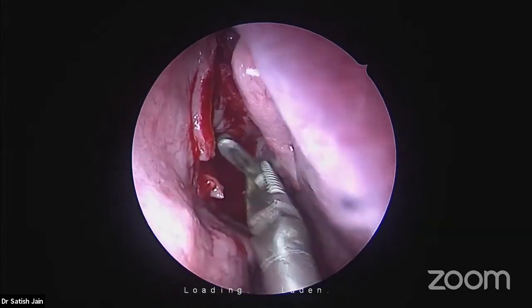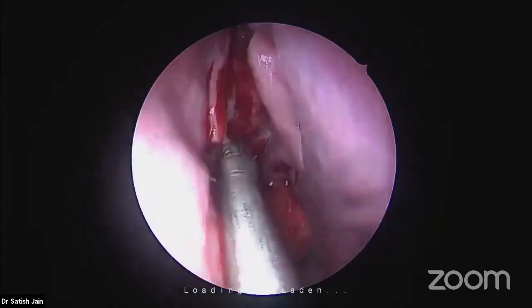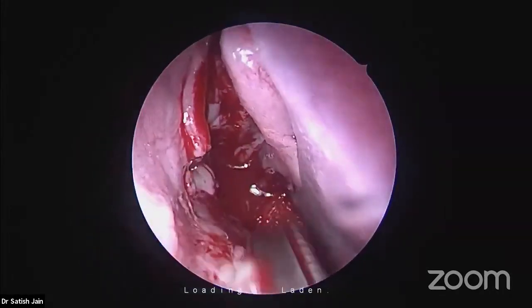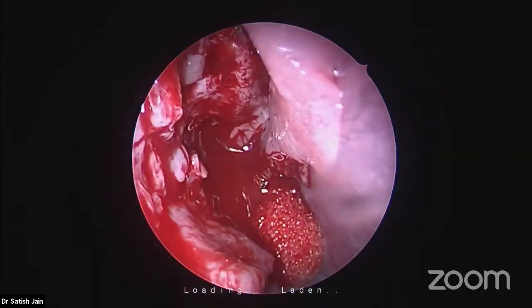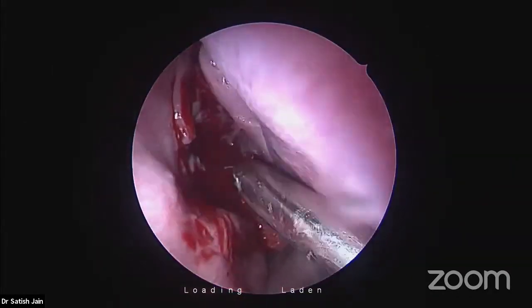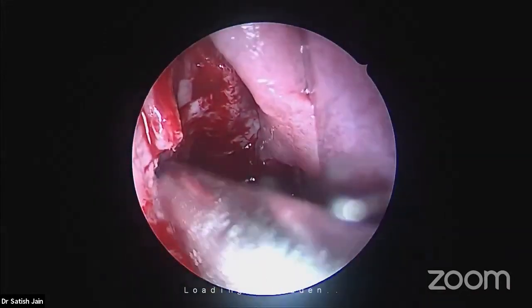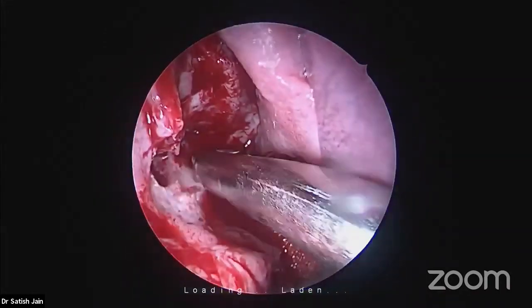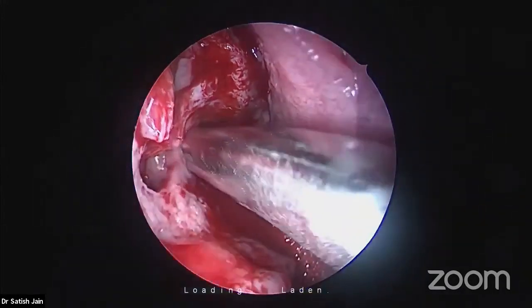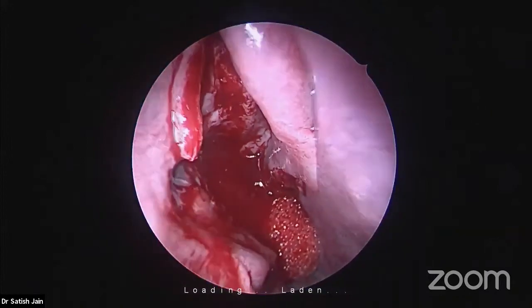This step is known as infundibulotomy. The only concern while coming this anteriorly is the nasolacrimal system. Release it. You have to be careful. If you find any hard thing coming across, stop there rather than biting through the nasolacrimal system. See, I'm just removing. What I have done is infundibulotomy. This three-dimensional space is the infundibulum, where the polyps are coming.